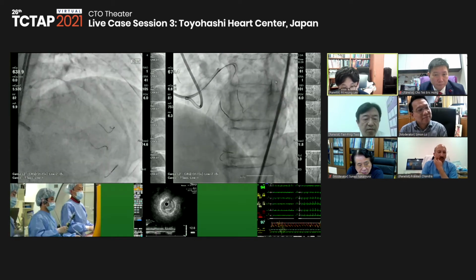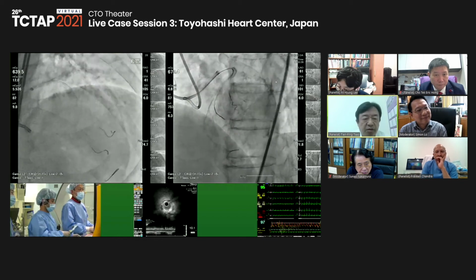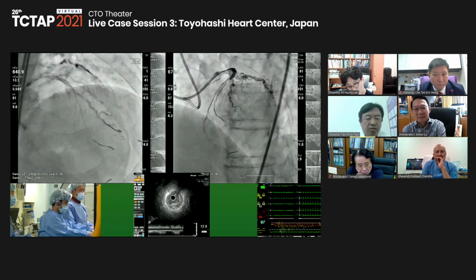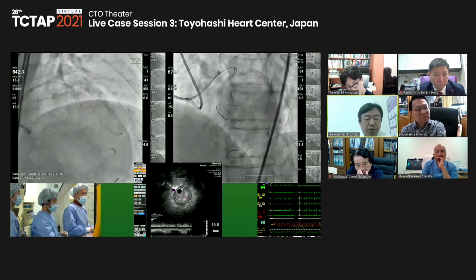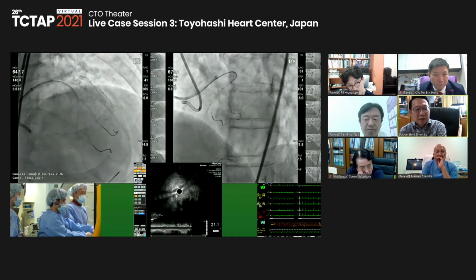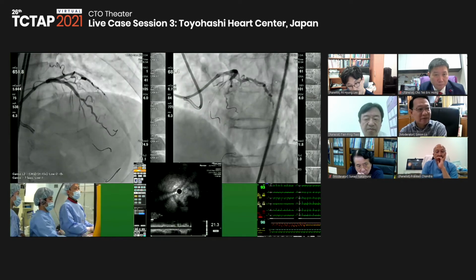Yeah, but I'll probably choose a 3 millimeter stent because the diameter at the second diagonal branch was about 3.5 millimeter according to the IVUS. So probably I'll use a 3.0 stent. And then proximally, before the diagonal, you may want to do a POT or something in the end and make it like 3.5.